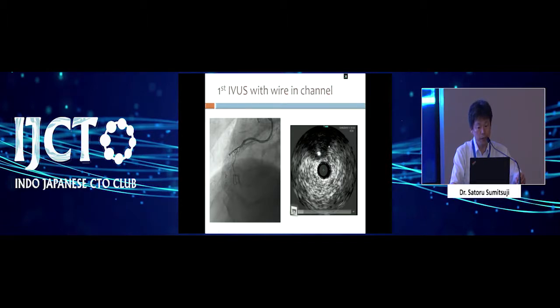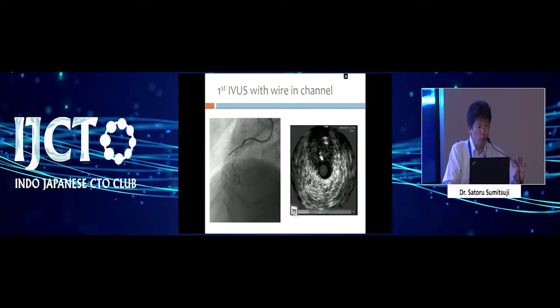And this big something, of course, must be the main coronary. And this is the side branch. Side branch is much, much smaller than this main branch. And the main branch is round shape without lumen. No lumen, no blood flow signal. That means, okay, this is total occlusion. Oh, this is surely we are checking the entry of the total occlusion, okay?